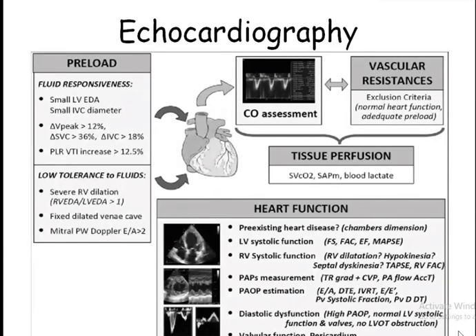You can also assess the cardiac output, calculated with various parameters, and the afterload. And one important thing we routinely do with echocardiography is to assess the fluid responsiveness.